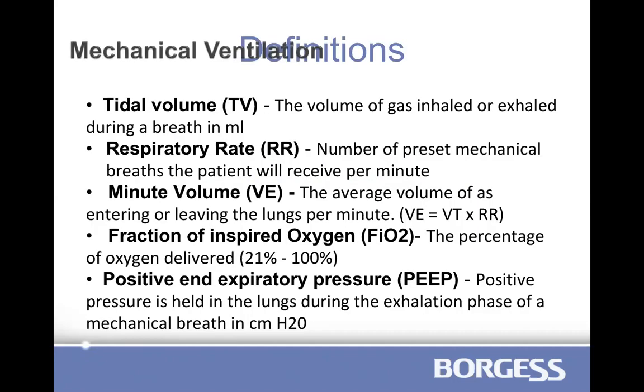Okay, so this is just so everyone is on the same language when approaching the ventilator. I've given all of the abbreviations along with the full names and the definition. Tidal volume is the volume of gas inhaled or exhaled during each breath. It is always measured in milliliters.